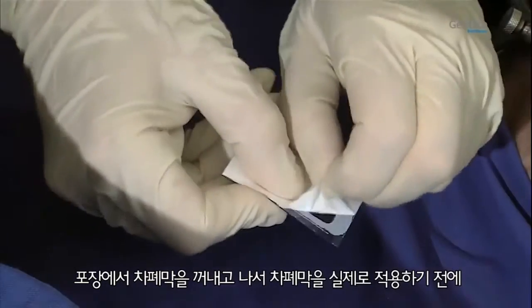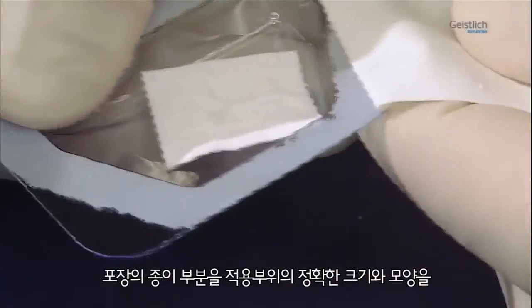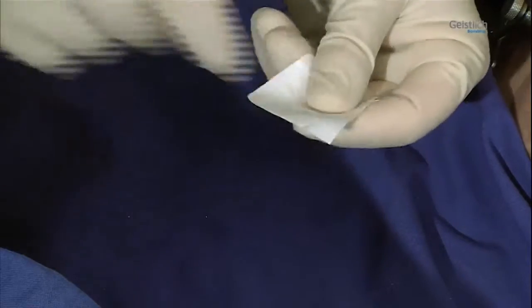Once we have removed the membrane from its packaging, the paper of the blister pack can be used as a template to determine the proper size and shape for the membrane before working on the actual membrane.